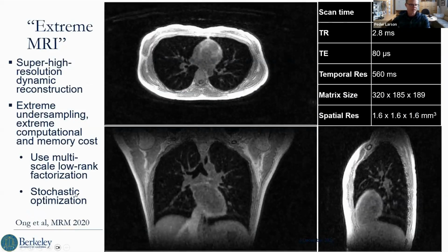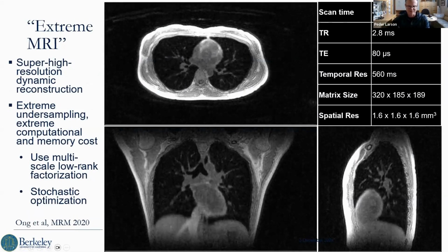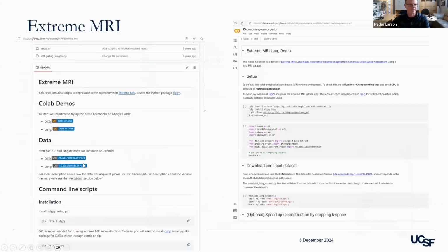Technique-wise, we went a little bit further. These are a little nicer looking dynamic image navigators. Always fun to look at, but we're not here to look at those. We're here to talk about open science. This was done by another student, now in Python as opposed to MATLAB. Sample data sets again, a couple of dependencies showing up here, SigPy, CUDA.